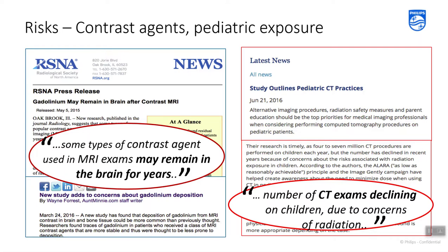There is certainly a growing awareness, and the number of CT procedures performed on children has declined in recent years. For certain clinical exams, we can avoid the repeat CT or MR scans, and we can take advantage of fusion imaging.